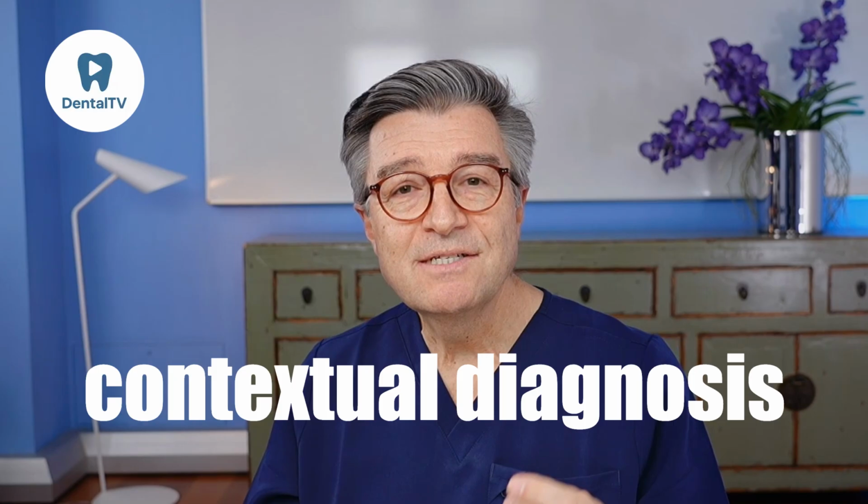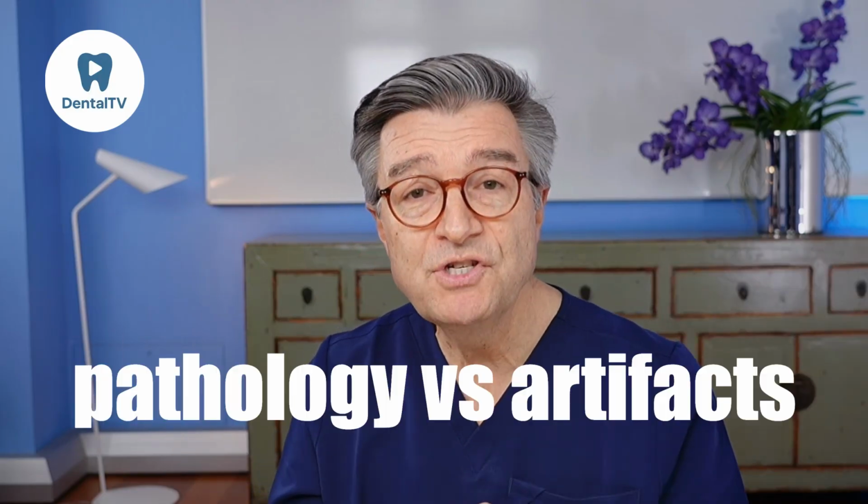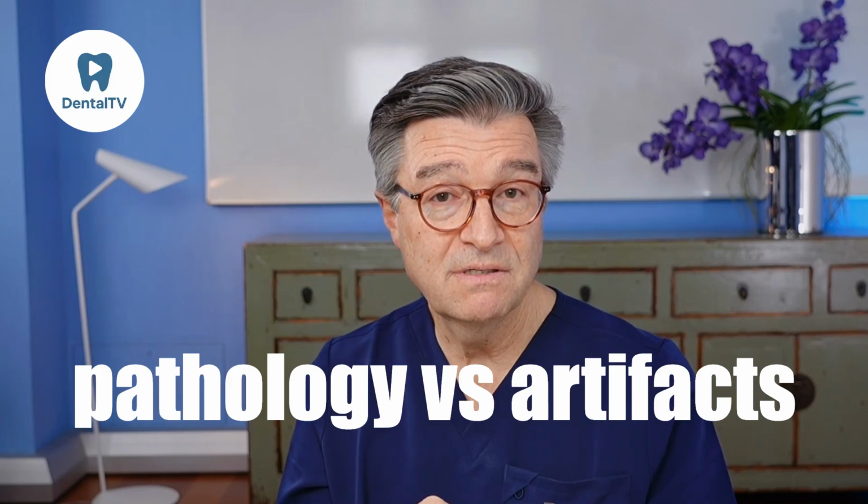The third principle is contextual diagnosis. A real finding must appear in all 3 planes. A radiolucency in axial must also appear in sagittal and coronal. A defect in the cortex must be visible from multiple directions. Real pathology has volume and consistent borders. Artifacts do not. The fourth principle is correlation. CBCT findings must be evaluated together with the clinical exam, probing depth, patient symptoms, intraoral photographs, and 2D radiographs. CBCT does not replace other modalities, it integrates them.